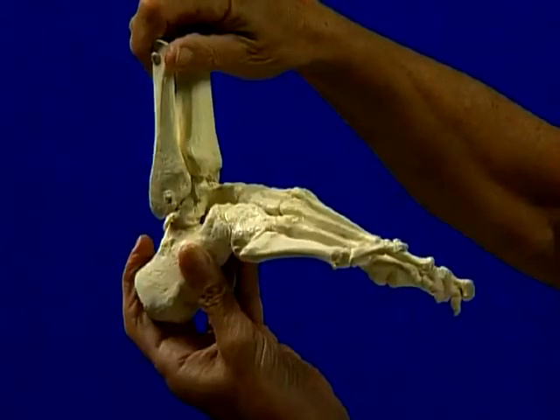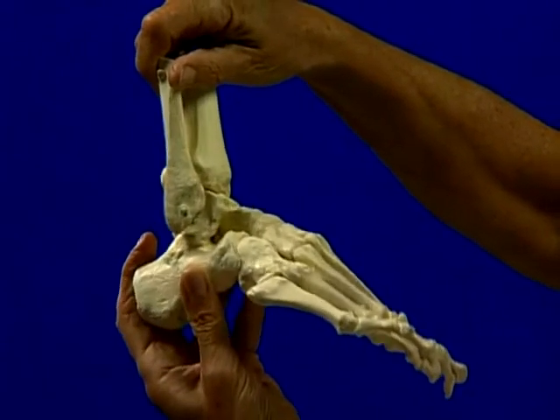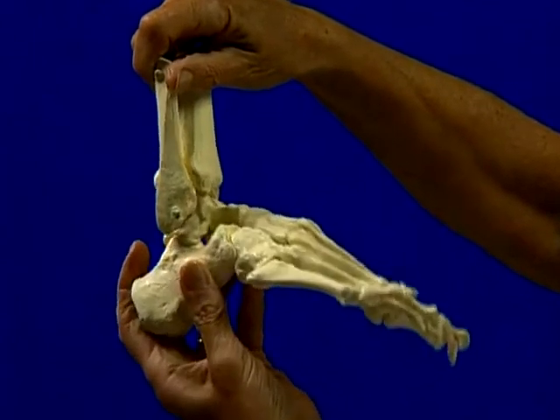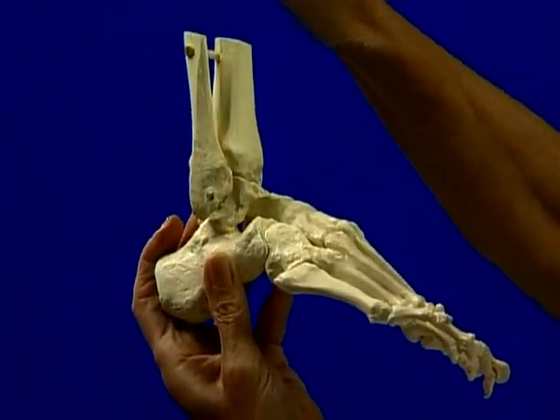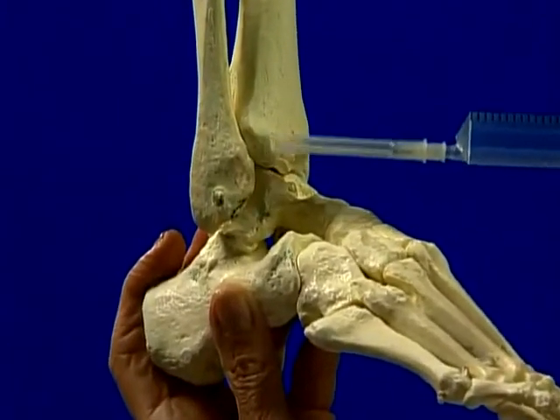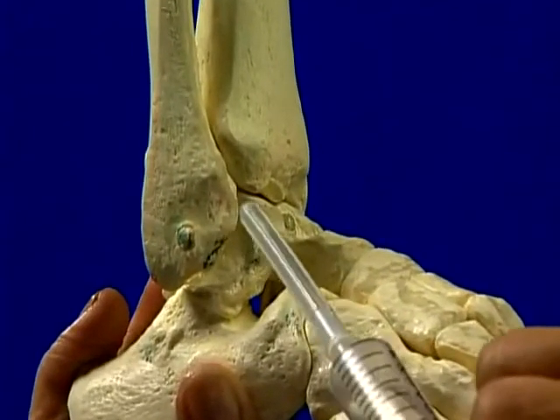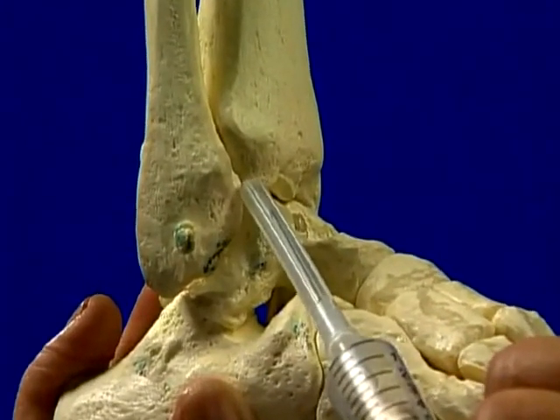The safest and easiest point to inject the ankle joint is on the lateral aspect. Passively plantar and dorsiflex the foot and identify the small triangular sulcus on the anterolateral aspect of the joint. Insert needle and move upwards and medially to enter the joint space.